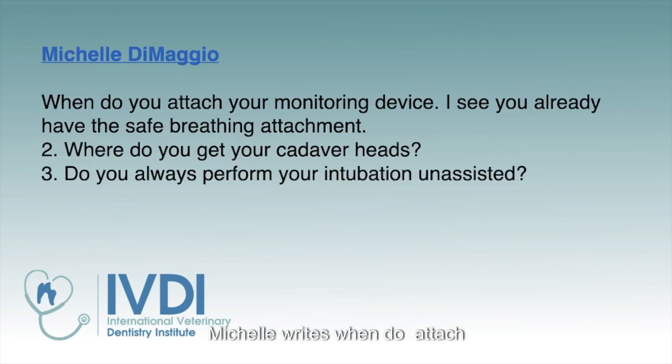Michelle writes, when do you attach your monitoring device? I see you already have the Breathe Safe attachment. And again, typically once they're in dorsal recumbency, we hook up the fluids and all of the leads. We will have to adjust them again, depending on what surgical procedure is going to need to be done. But in most cases, it's once they're on their back, and then we can hook those leads up very, very easily.